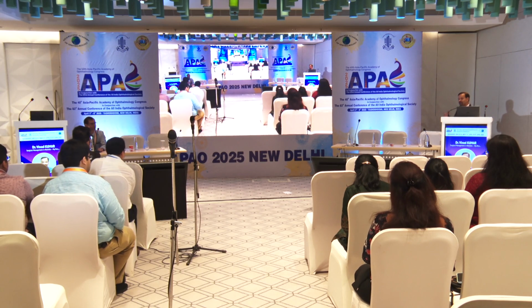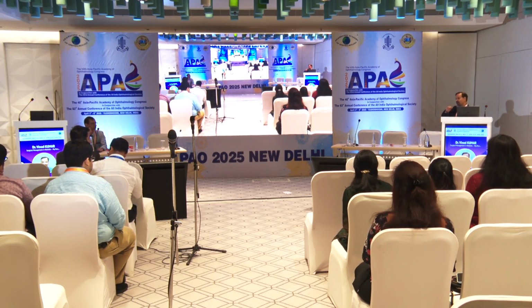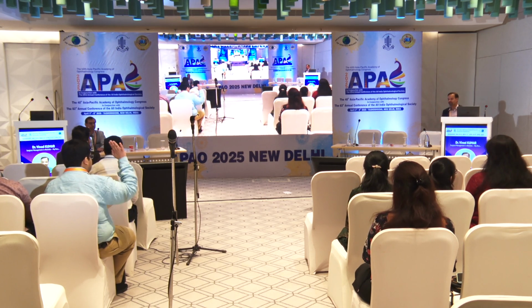And especially in HIV positive patients, I think there is a bit of an issue, because one would not want to go in opening the conjunctiva, and there are more chances of splashes and all those things. So there are issues, and once you have a wide strip of peripheral retina which is already necrotic and scarred, I think it will not make much of a difference even if you put a band.